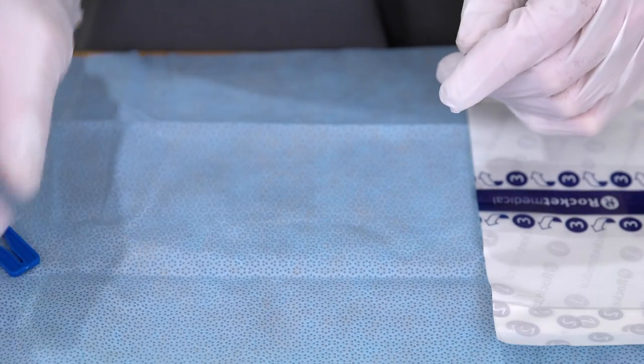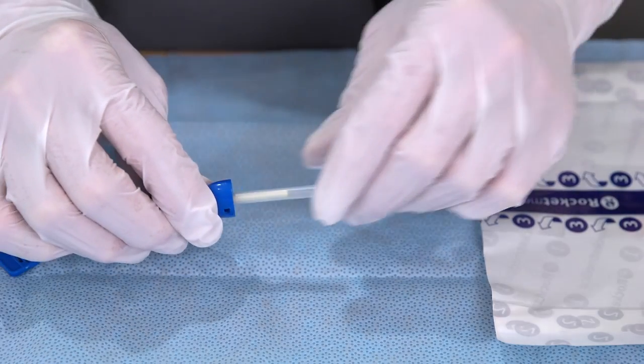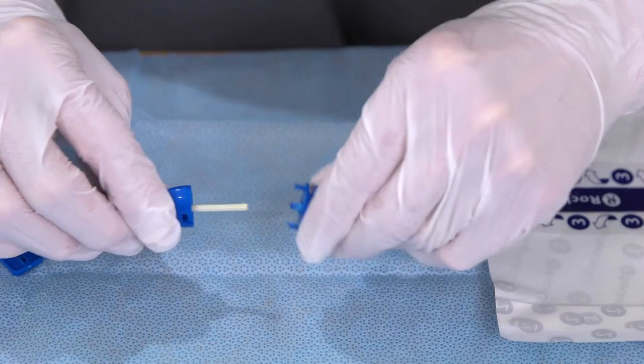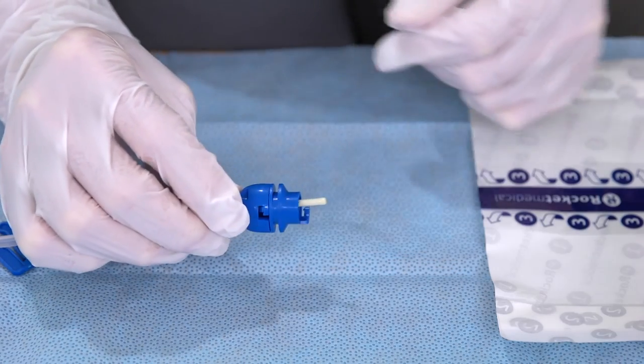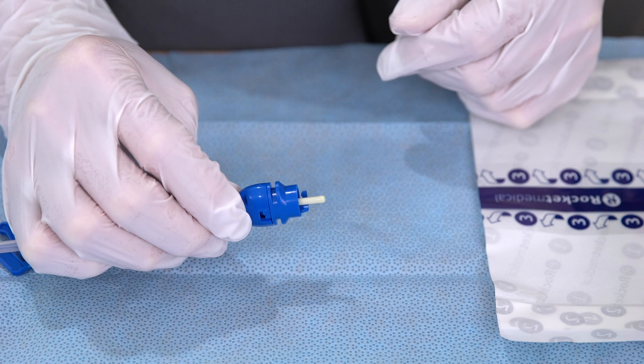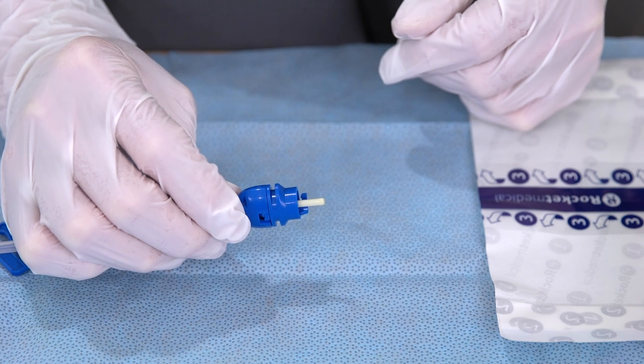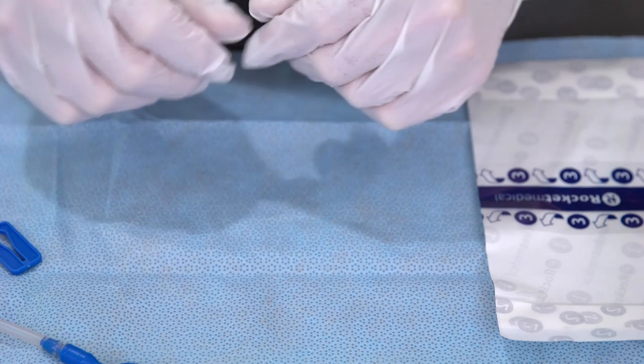Remove the access tip cover. Take the adapter and slide it over the access tip with the four prongs facing inward. Push the adapter and the drainage line together, so the four prongs click into the drainage line and become secure. Then set the drainage line down in the sterile field.